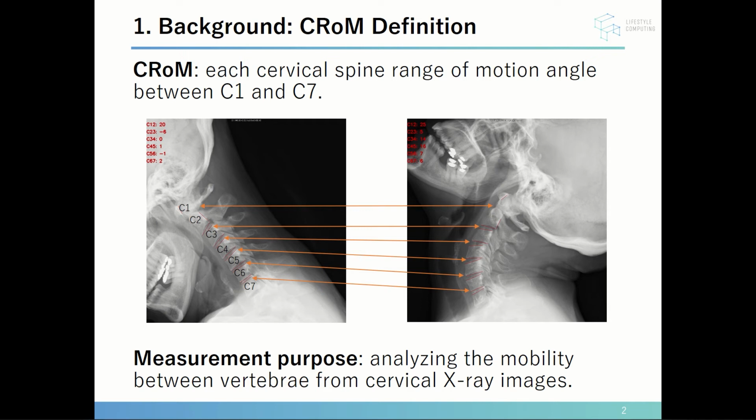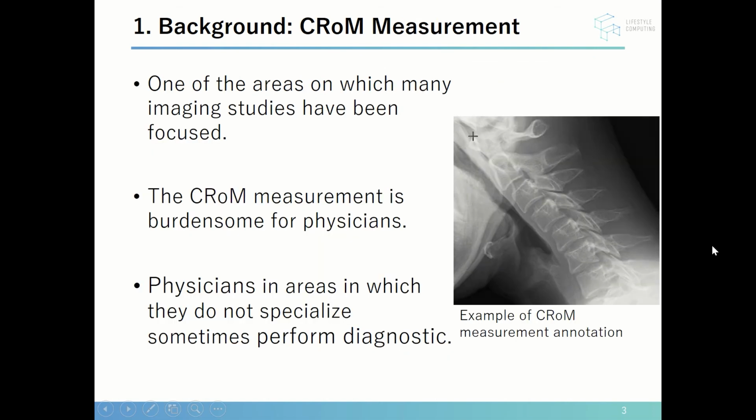The measurement purpose is analyzing the mobility between vertebrae from cervical X-ray images. Physicians use CROM as a basis for making diagnosis decisions.